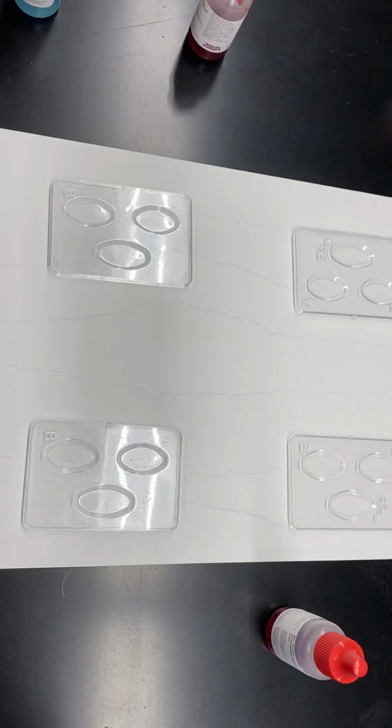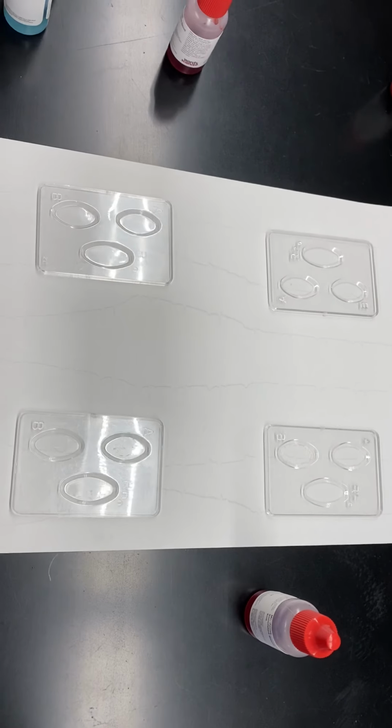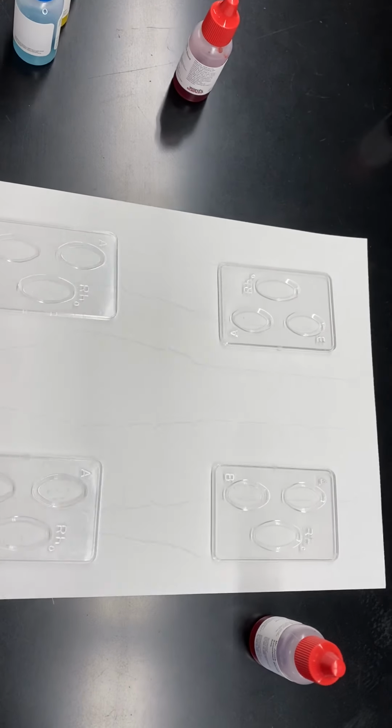Okay guys, so today we're going to do a blood typing case. If you have watched my previous video, you already have learned how to do the typical blood typing. So here is basically the experiment you guys would be doing normally in the class. I'm gonna run the experiment for you, and based on the data you're observing, you can answer the question and complete the chart for the blood typing sample.